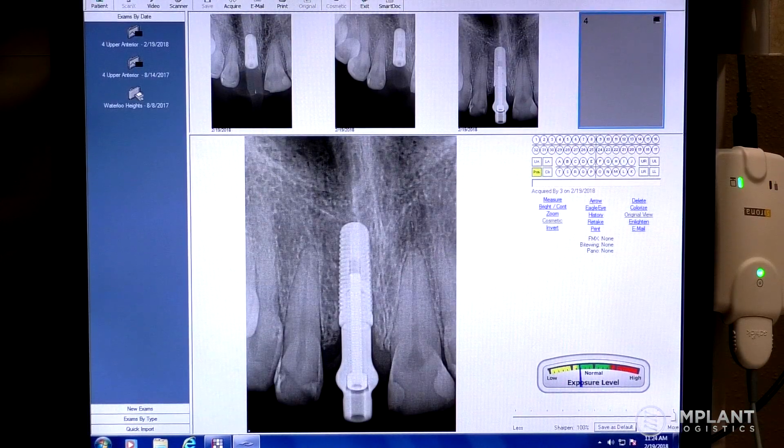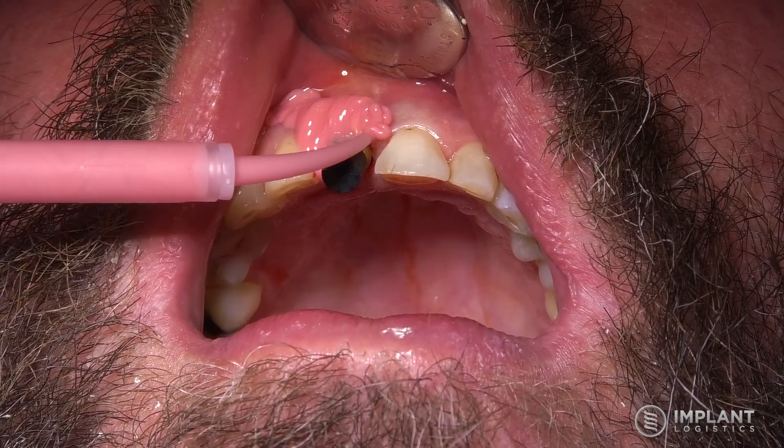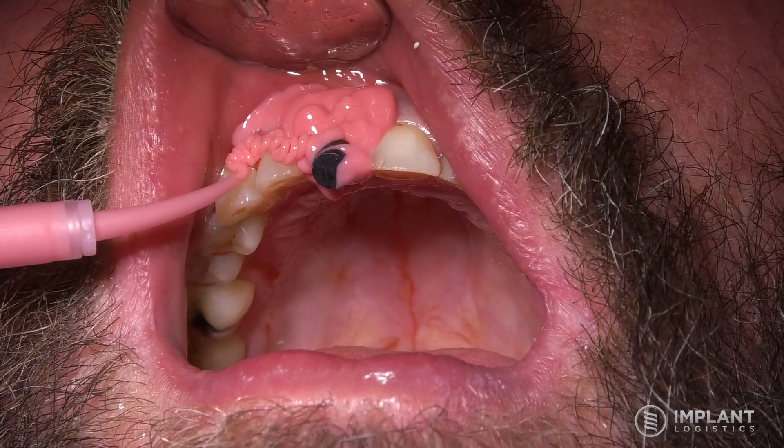I always at this point take a periapical x-ray. What you're doing that for is to verify that everything is fully seated and not interfered with in terms of bone or tissue. That x-ray should then be sent with your case to the laboratory so they can determine how far subcrestal the implant is placed.